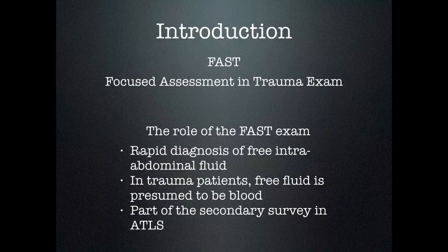So what does FAST exam stand for? FAST means Focused Assessment in the Trauma Exam. The role of the FAST exam is to rapidly diagnose free intra-abdominal fluid. In the trauma patient, we assume this free fluid to be blood. This may or may not be the case, as we'll see later.